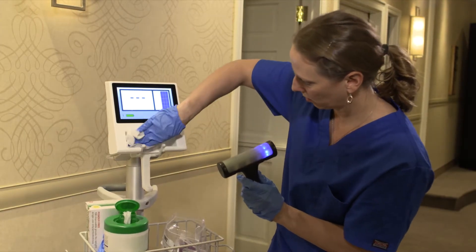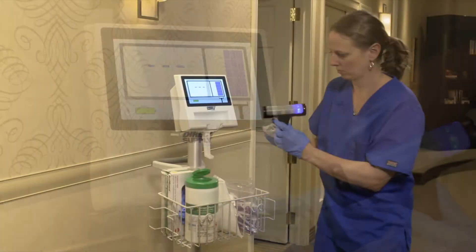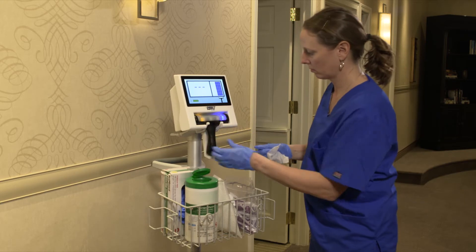Disinfect both the probe and the console with bleach wipes or any hospital disinfectant. After cleaning and disinfecting the probe, inspect for cracks or damage. Do not use the bladder scanner if it is damaged in any way.